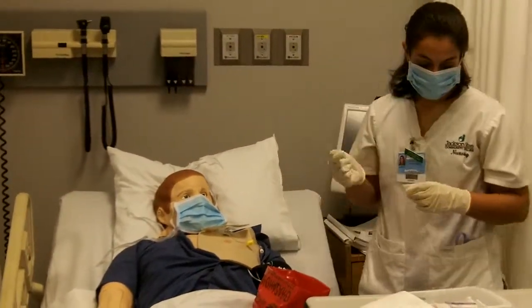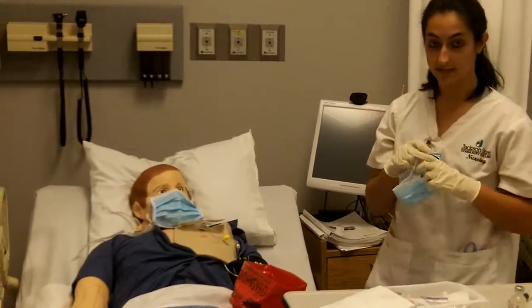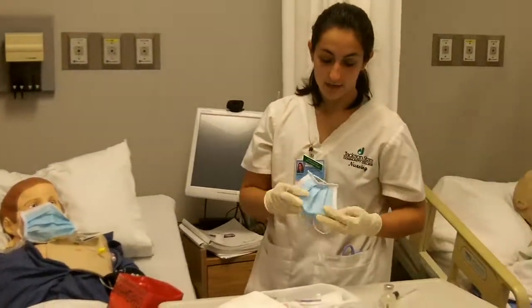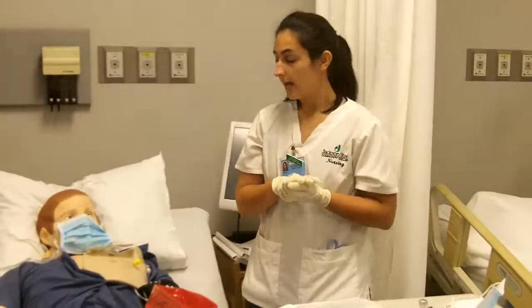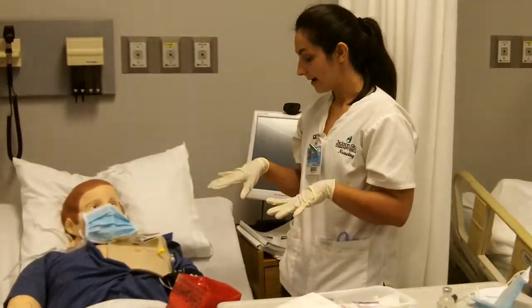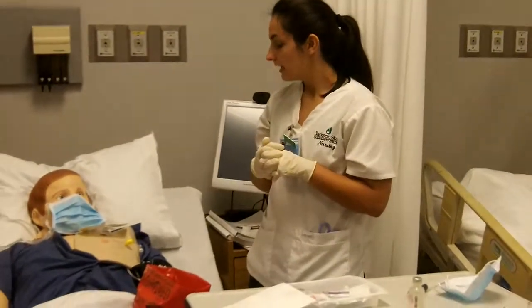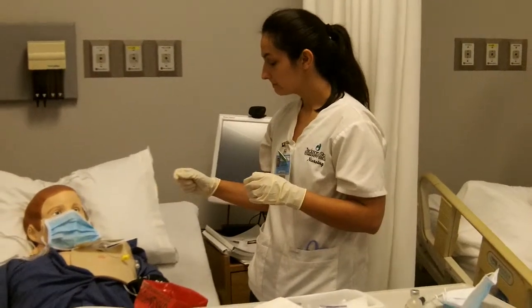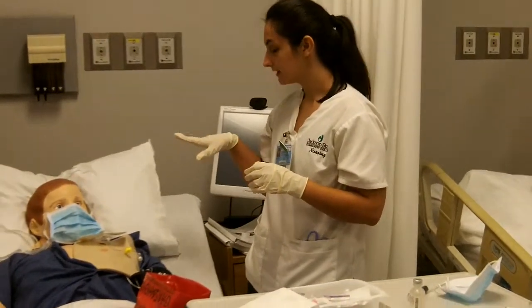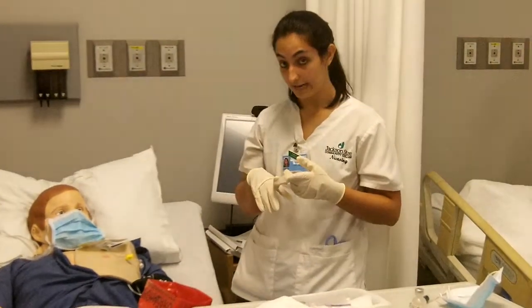If I were to come in and have an order for a dressing change, I would have my dressing change kit. I would verify my order. I would state the patient's name and patient identifiers. Then I would use clean gloves. I would remove the dressing. I would assess for edema, swelling, tenderness, or any pain.